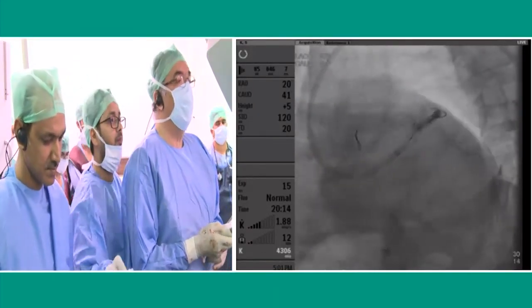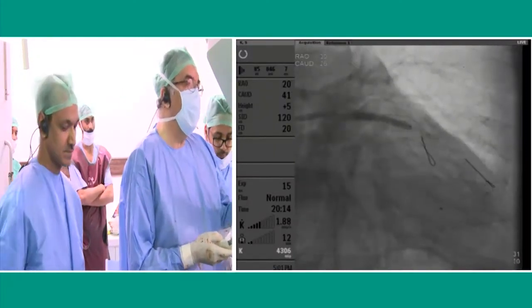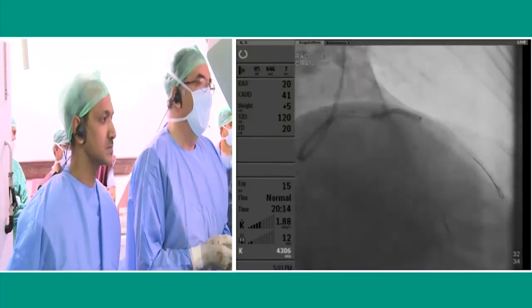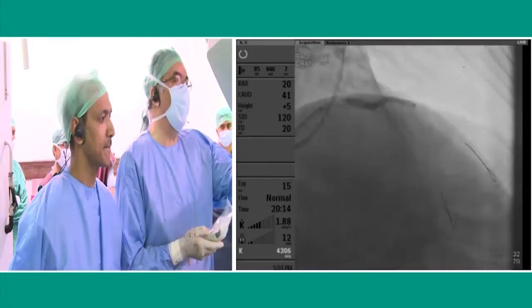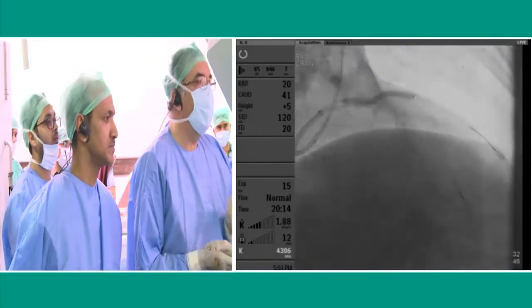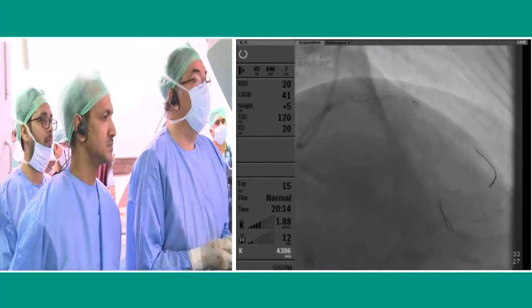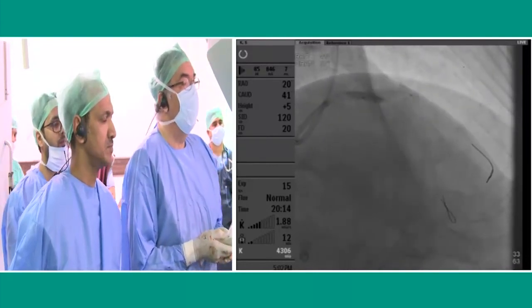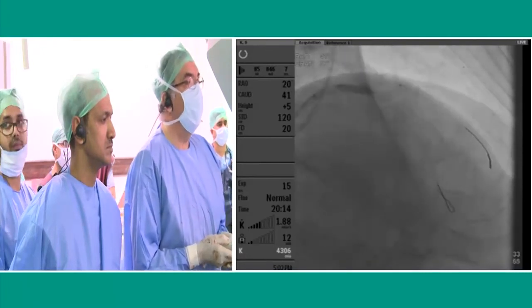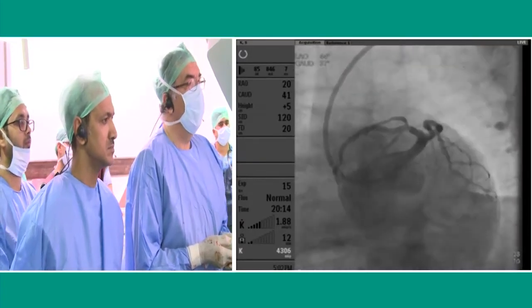Then we open the stent, and then I pull back the balloon inside the left main, and we took 21 atmospheres. You see that the proximal marker of the balloon is more proximal because we are really inside the stent. And then we did the final kissing balloon with a 4.5 and 3.0, up to 20 atmospheres. And this is the final result.